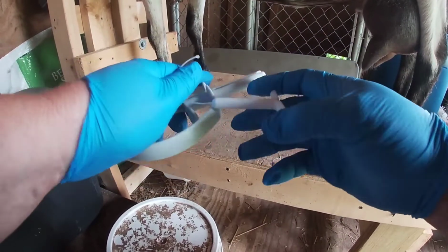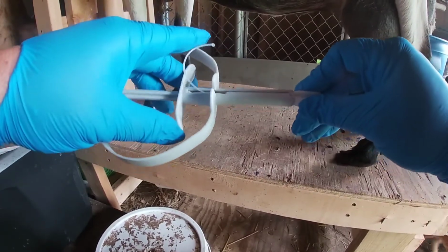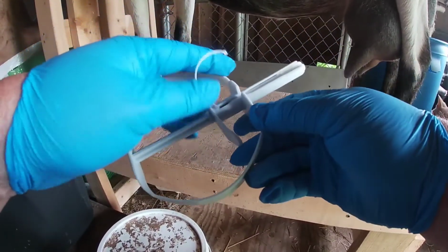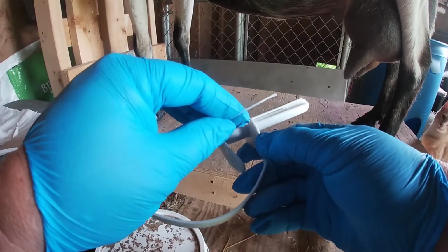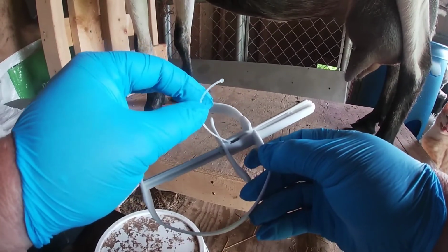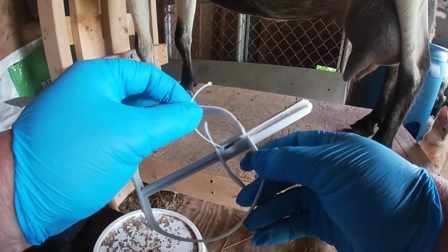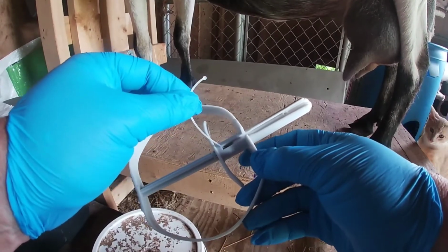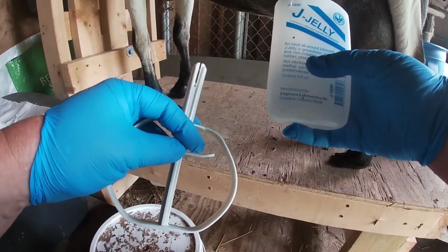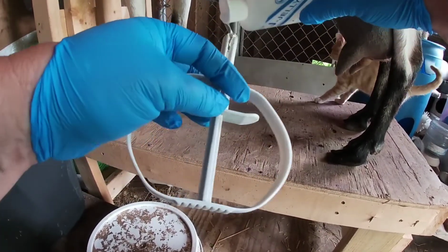So just like before, you squeeze the little wings together and you slide it into the applicator like so. Make sure it's in there. You've got this little tail here. Now sometimes after you have put these in your does, you won't see this little tail because sometimes they kind of suck it up. But don't be afraid if they do that, because whenever you pull it out, you're just going to have to fish for it a little bit. It just happens. And your jelly can be any kind of jelly. I just picked this up at a local veterinary supply, and it's called J Jelly.